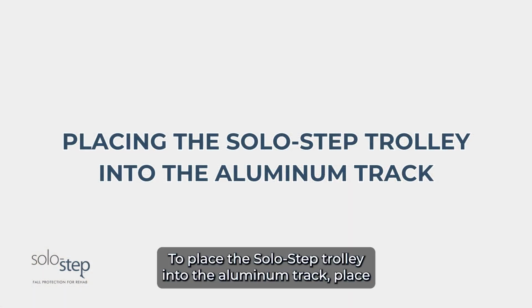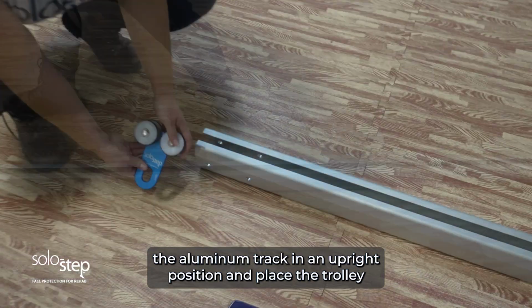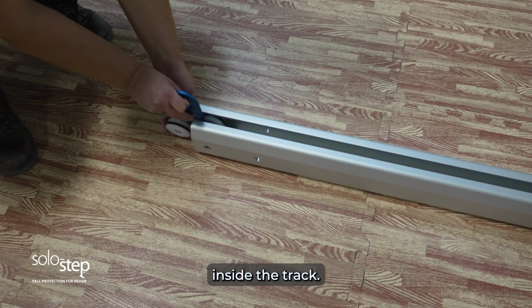To place the Solo-Step trolley into the aluminum track, place the aluminum track in an upright position and place the trolley inside the track.